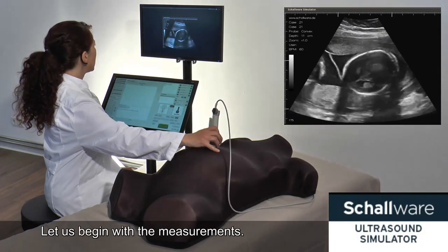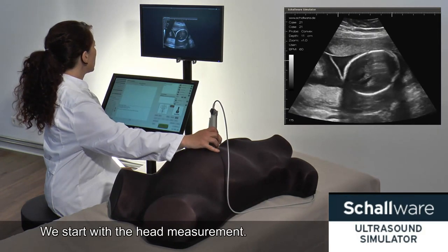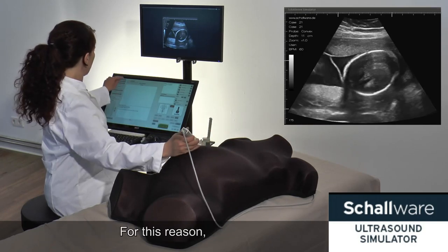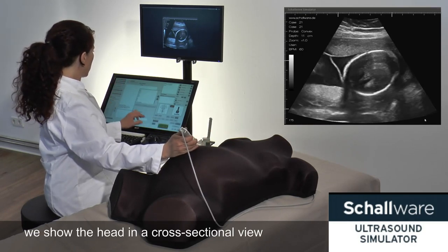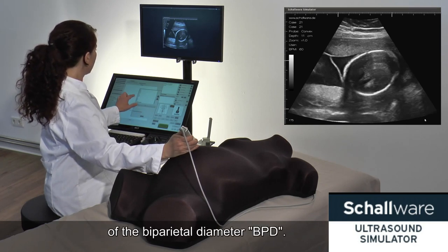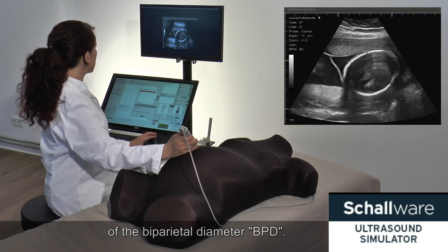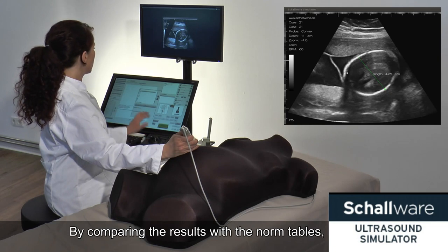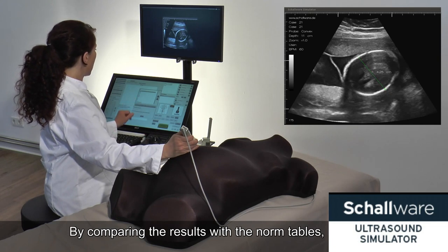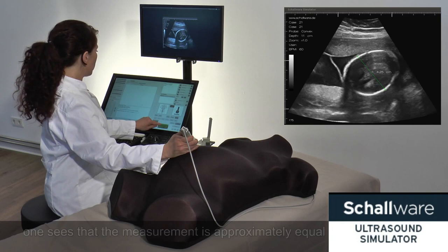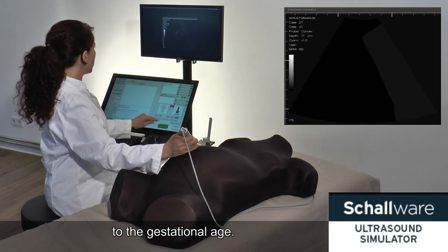Let us begin with the measurements. We start with the head measurement. For this reason, we show the head in a cross-sectional view, as an ellipse, and perform the measurement of the biparietal diameter, BPD. By comparing these results with the norm tables, one sees that the measurement is approximately equal to the gestational age.